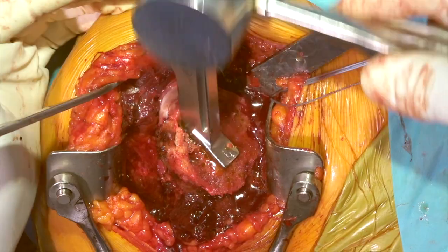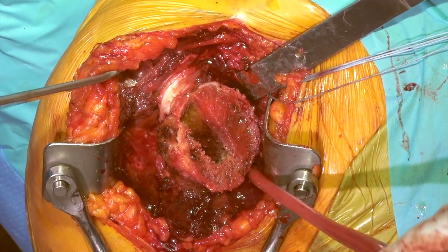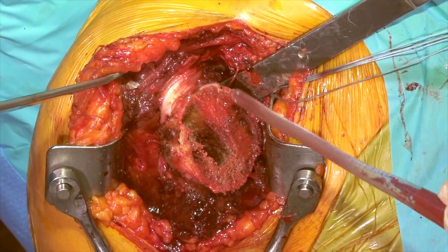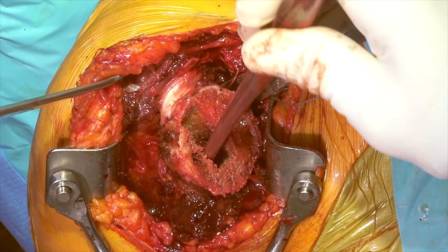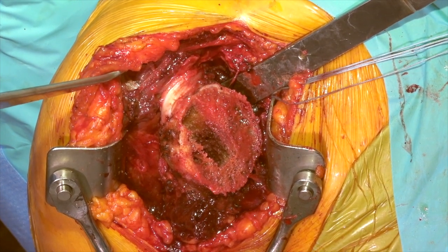We'll take this out and let the circulating nurse know that we've decided the size of the humeral head is a 46, and the size of the stem going down the humerus is a size six, so they can work on getting those implants into the room in a timely fashion.